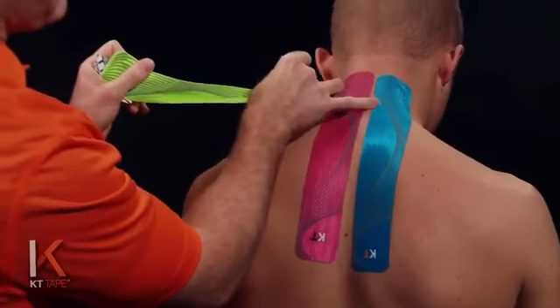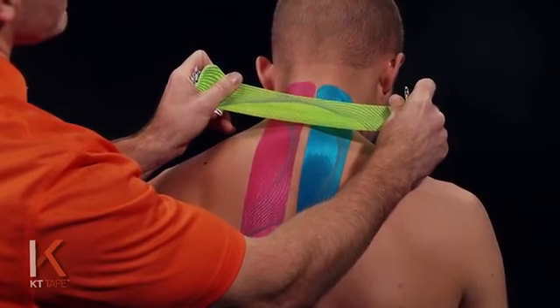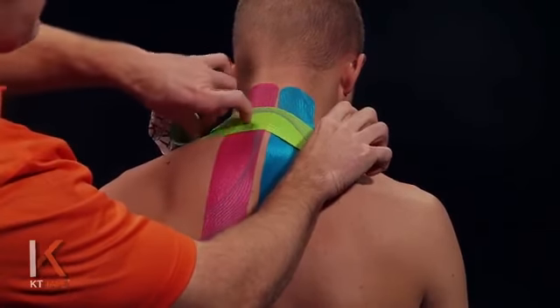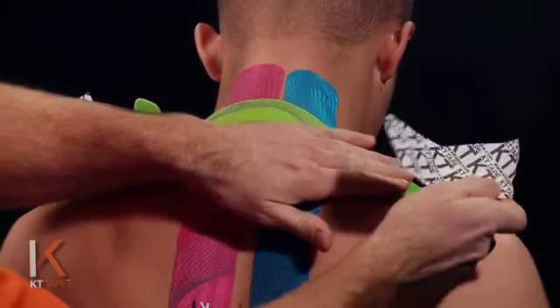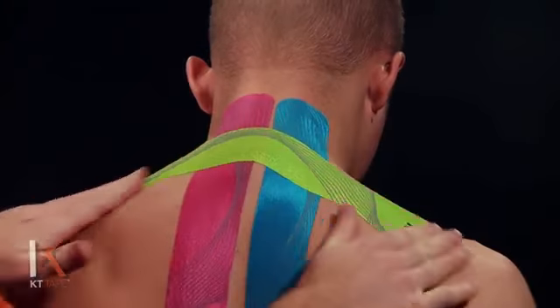And if we have a point of pain in this area, I'm going to stretch this piece 80%. So if I go all the way out and back that off just a little bit, I'm going to go ahead and lay that piece down with 80% stretch. And I'm going to lay that down just like with the first two. The ends of the tape I'm going to place on the skin with absolutely zero stretch. So I'm taking that paper off and laying that down with absolutely zero stretch.